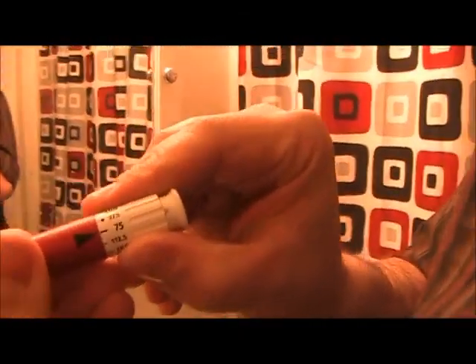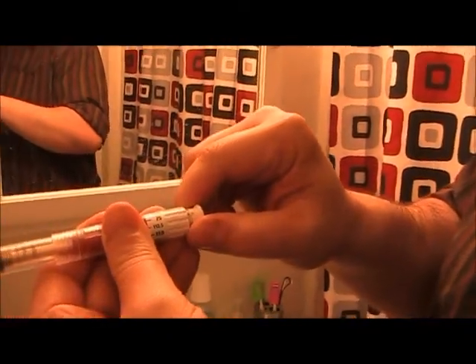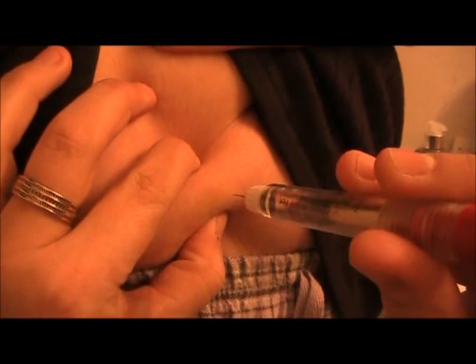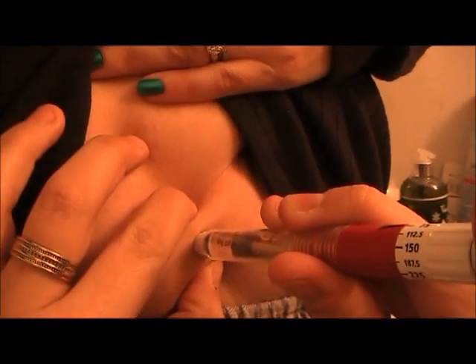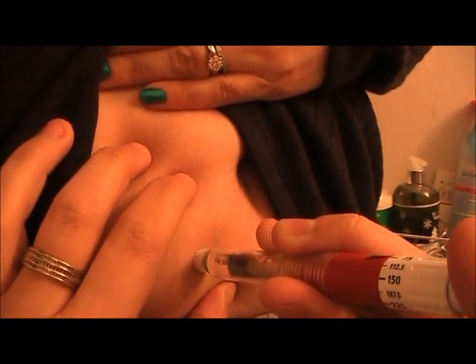We've swabbed the injection site and this is good to go. I will dial it up to the dose tonight, which is 75 — because this is the last dose, we've been doing 225, but now it's 75. Pull it back again, that was two clicks because two arrows, so 75. Now we're going to do the shot. You'll probably see she's a little bruised from all the previous injections. Boom. And we hold it in for five seconds — one, two, three, four, five. Boom. All done.